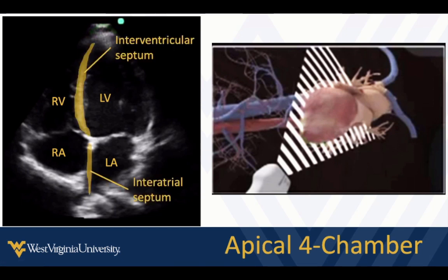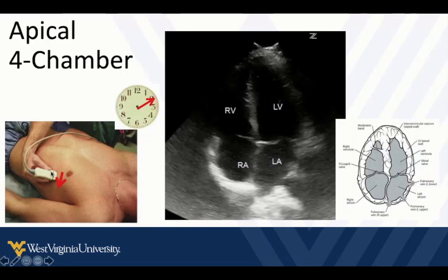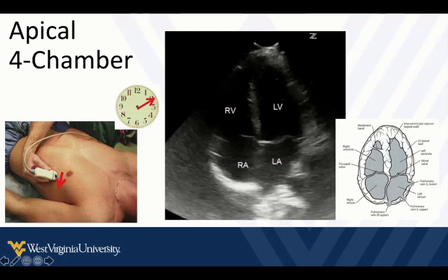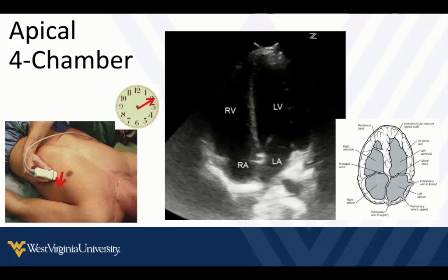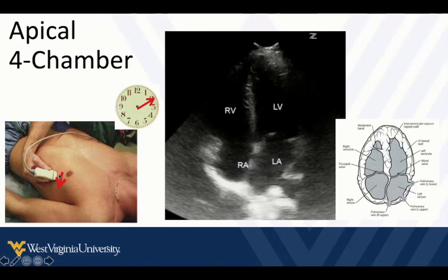There we can see the interventricular septum, and there's the interatrial septum. Let's look at this in real time. Here's roughly our probe positioning — this is where you start looking, but you'll make adjustments to help you find it. It's very important to recognize and differentiate the left ventricle from the right ventricle, because sometimes we make mistakes if we're not in a cardiac setting or we don't realize our indicator is in the wrong direction.